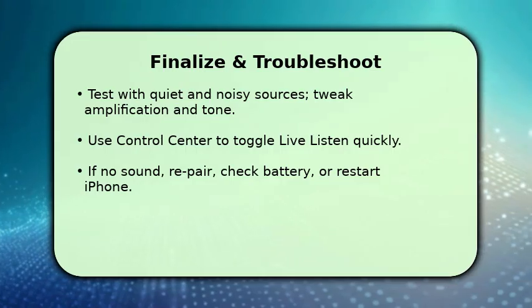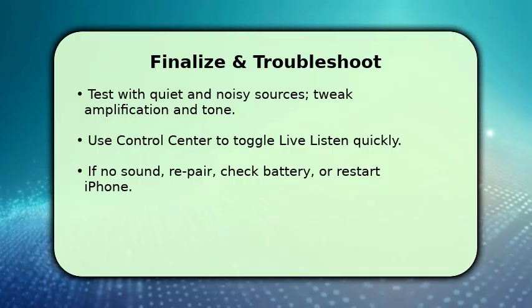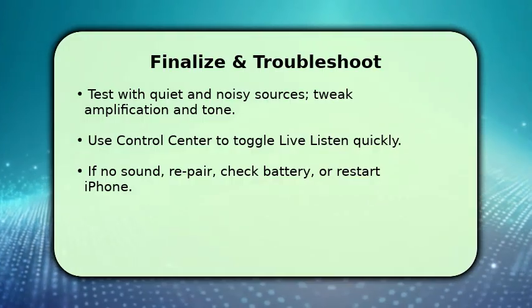If things go wrong, no audio, choppy sound, or no connection, repair the AirPods, ensure both batteries are charged, restart the iPhone, and re-enable the features. That sequence fixes most issues.